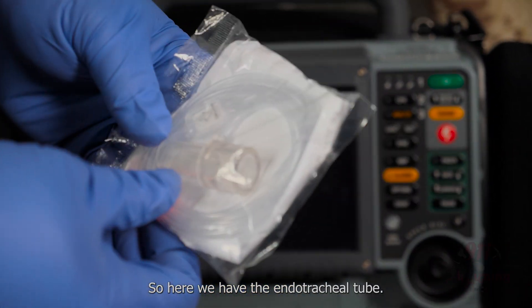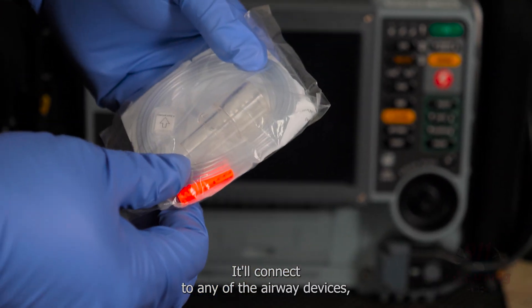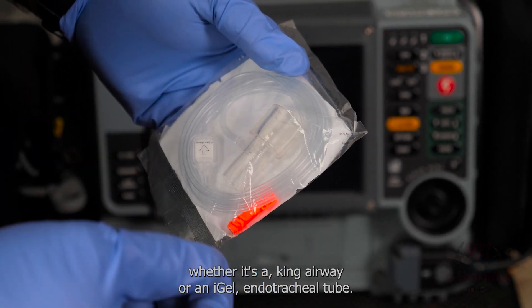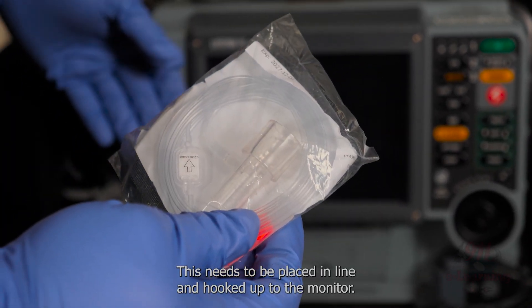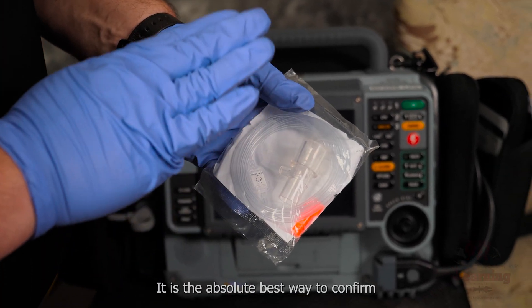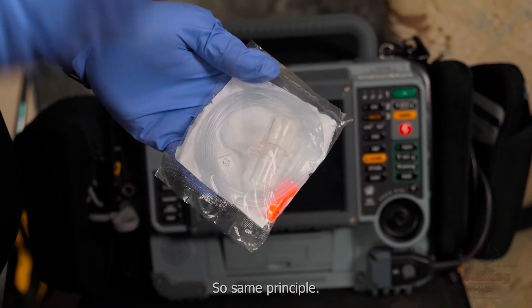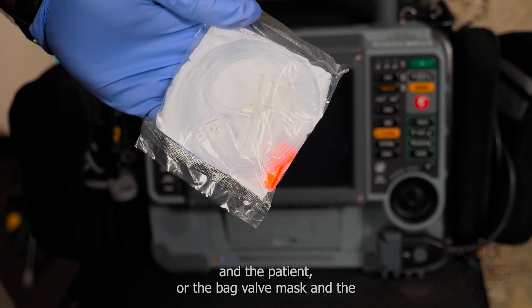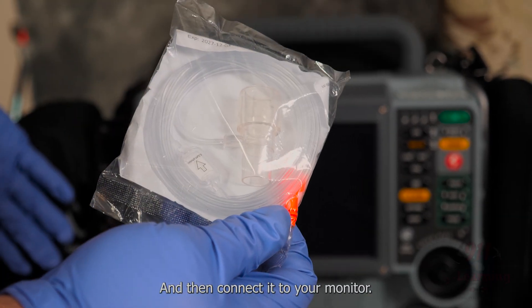Here we have the endotracheal tube adapter. This connects to a bag valve mask — it'll connect to any of the airway devices, whether it's a King Airway, an IGEL, or an endotracheal tube. This needs to be placed in-line and hooked up to the monitor. That is mandatory for any airway interventions. This connects between the bag valve mask and the patient, or the bag valve mask and the airway device, and then connect it to your monitor.